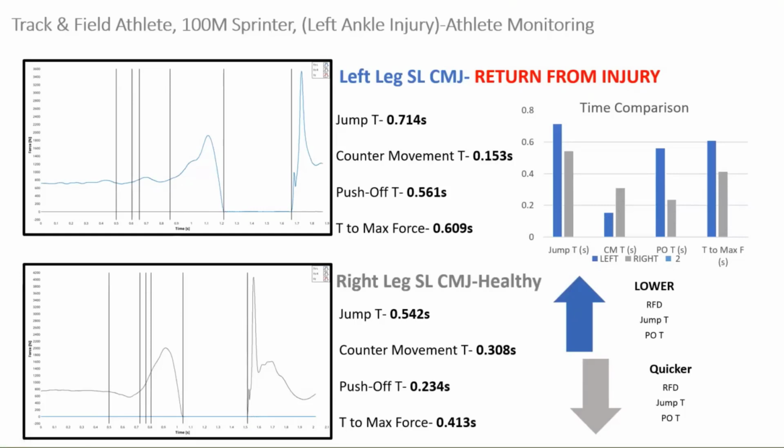That's how we monitor athletes coming back from an injury that are healthy enough to perform, but still need the strength coach to know it, and to explain it to the strength coach and the athlete for this matter. And they seem to understand, and it seemed to correlate with what he was seeing. And this is a high-level athlete, Olympic competitors.